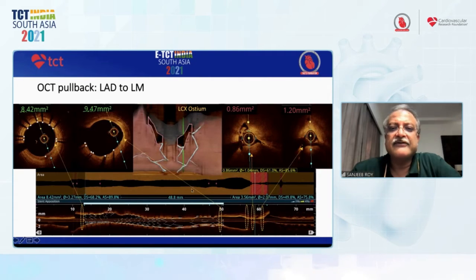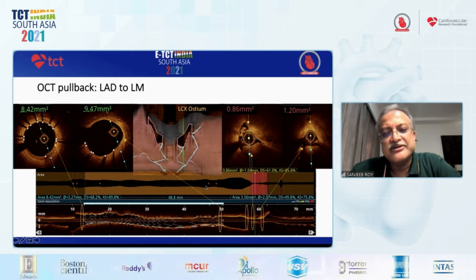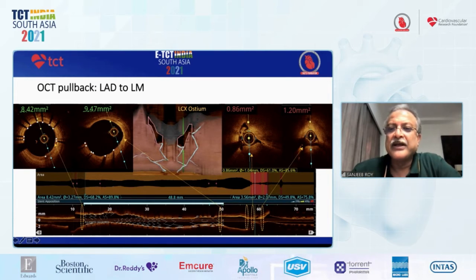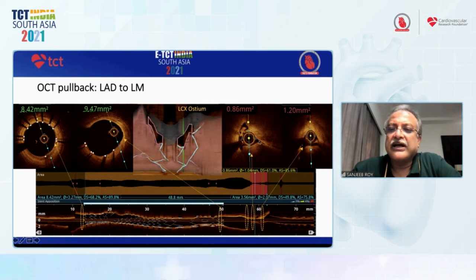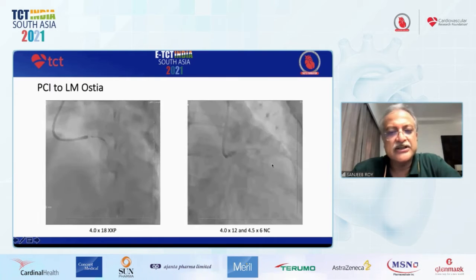As was evident, the stent had started from the distal left main. So I used a stent to just cover the proximal end of the previously deployed stent. You can see here the effect of the cutting balloon, the scores in a triangular fashion at the ostia.